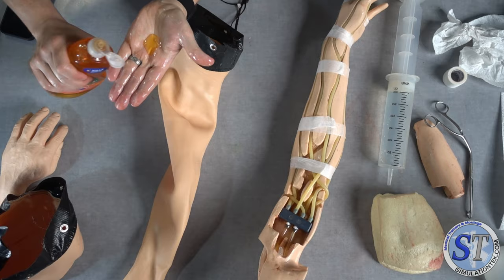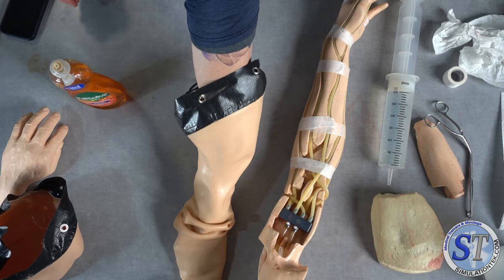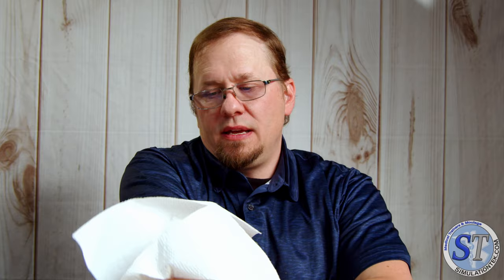I never really worry about how much to use because, again, in my use, it's always dehydrated out. And it's only benefited me later because if I want to do this again, all I have to do is inject water. How I really like to inject water all the way down is I use a trocar chest tube, which is a chest tube that's got a rod in the middle of it. You can just slide it nicely, you lubricate it with some soap, you slide it down there and you pull the rod out, and then I can attach my syringe and I can get water all the way down there. But not all of you out there have that, so I wanted to use just what I got around. You may not have a big syringe like this, but you should have a syringe.